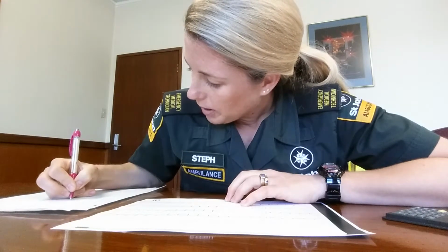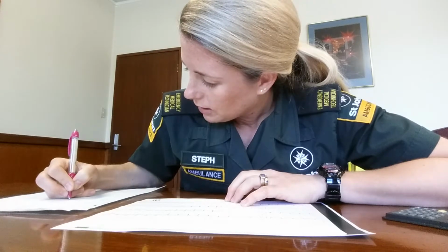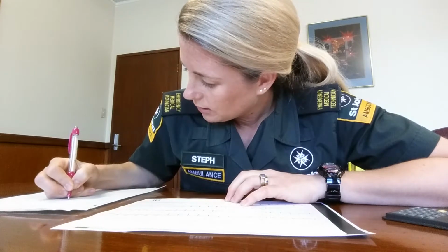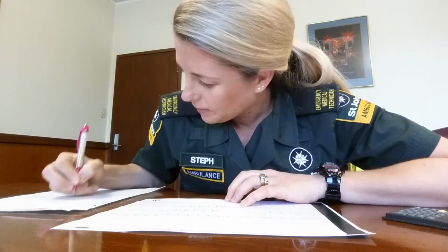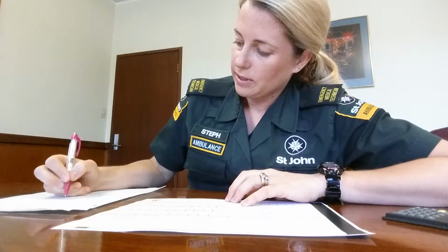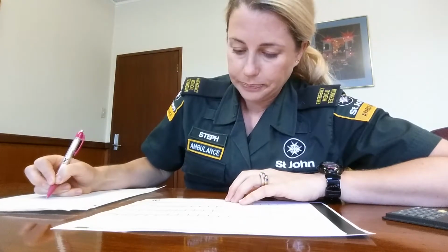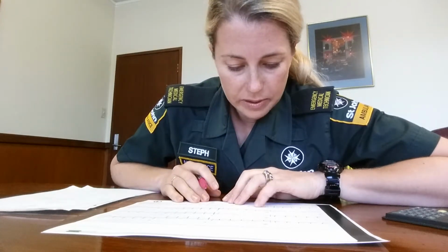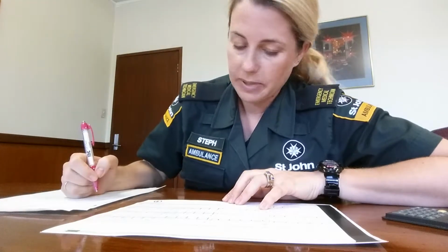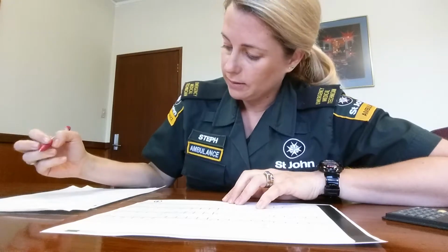So I'd say that's about between positive 30 and positive 15 degrees. Oh wait, right on 30. We'll say 30 degrees axis. What's the normal axis? And we have a bit of the smiley face for our STEMI, non-STEMI in the inferior leads.